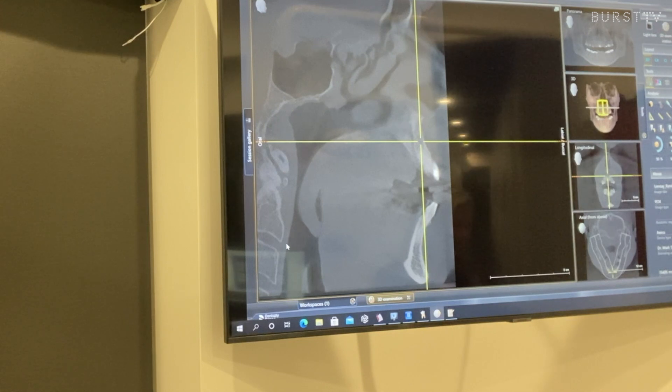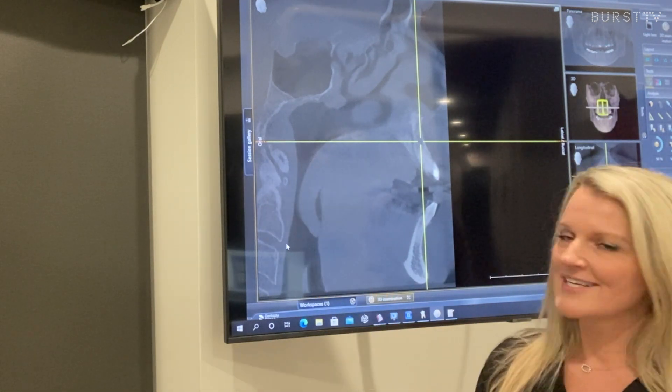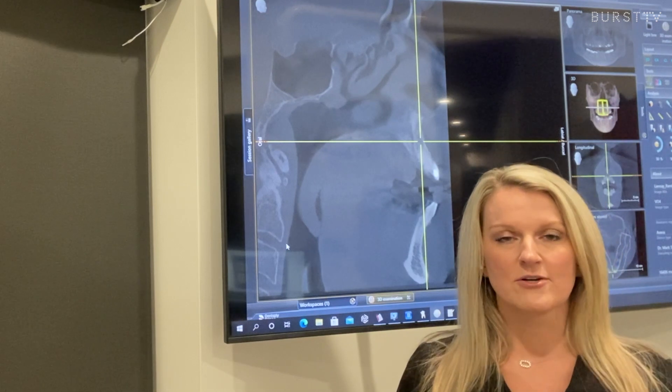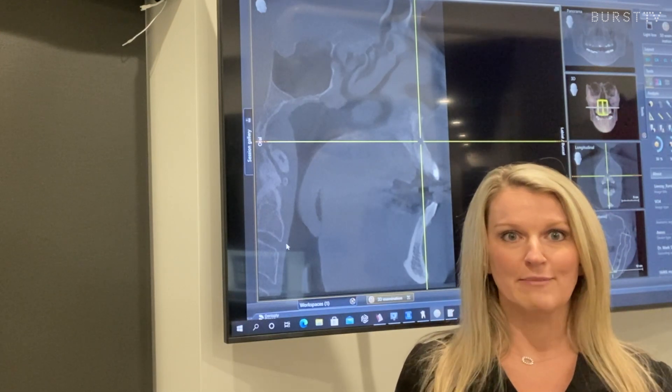You can also use this technology to screen for sleep apnea by viewing the patient's airway. We don't diagnose sleep disorders in our office, but it is a great screening tool to see a constricted airway and recommend the patient may need a sleep study. I will usually ask the patient basic questions about snoring and sleep quality before the doctor comes in. Once a sleep study has been done and sleep apnea is diagnosed, we can also make snore guards for our patients if they can't or just won't tolerate the CPAP machine. This patient's airway gets pretty thin as you come down towards the tongue. He had been told by his wife that he snored, so we recommended he get a sleep study and potentially a snore guard.